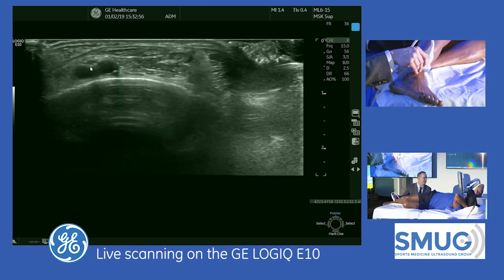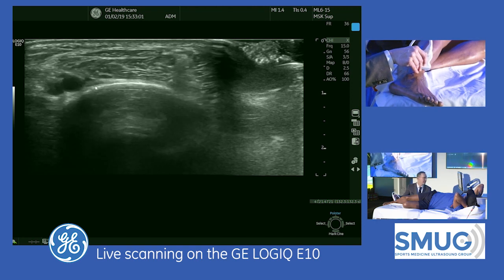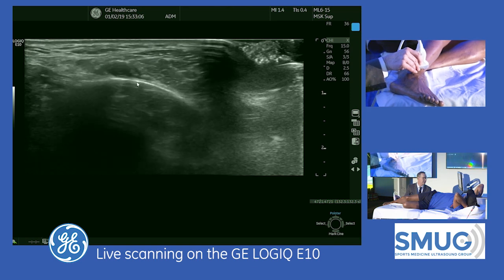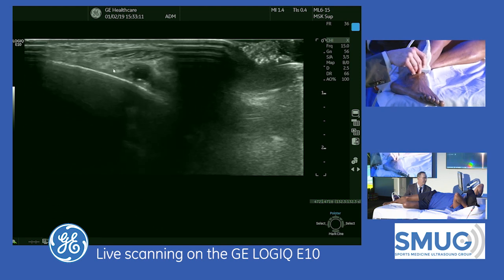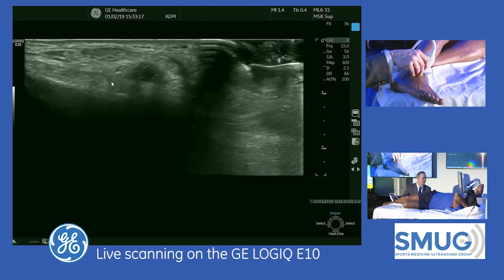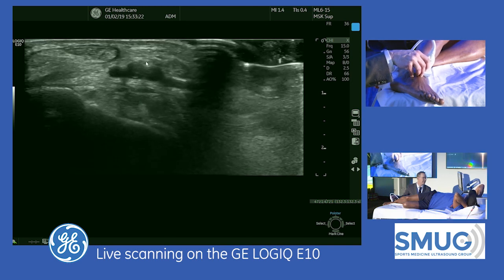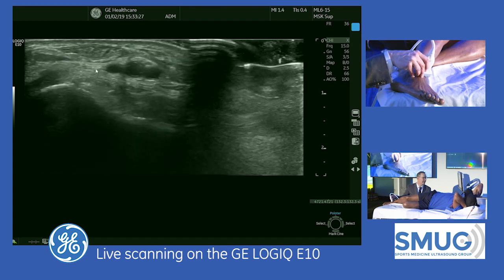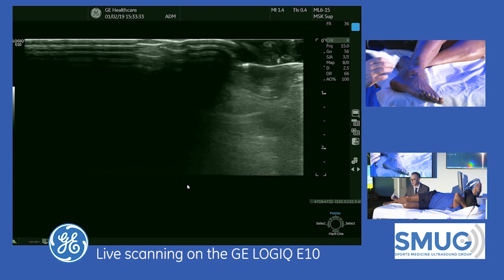If you go proximal, you'll see the nerve move to the medial part. It starts up medial to the anterior tibial artery, and as I go distal, it's going to move over and jump lateral to it. This comes into play if you're injecting the midfoot — keep in mind the branches of the deep peroneal nerve. You can see them arborize. That's why people with large osteophytes from midfoot osteoarthritis can have pain if they're pushing on one of those nerves.